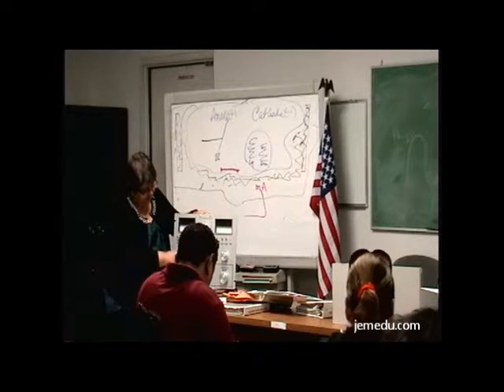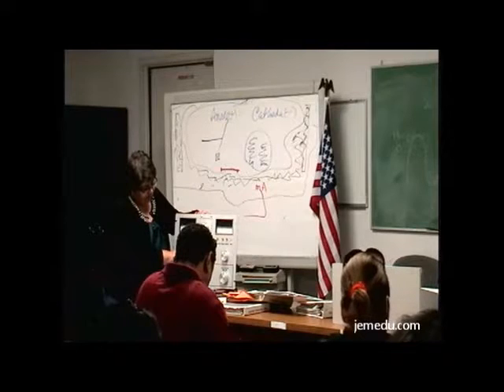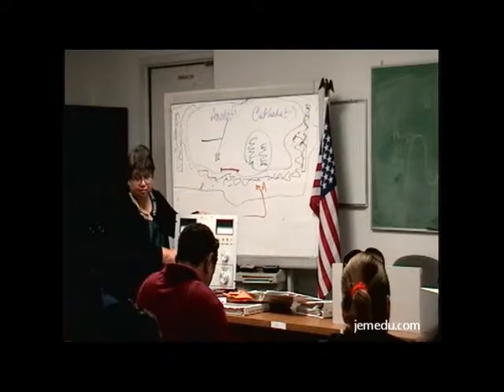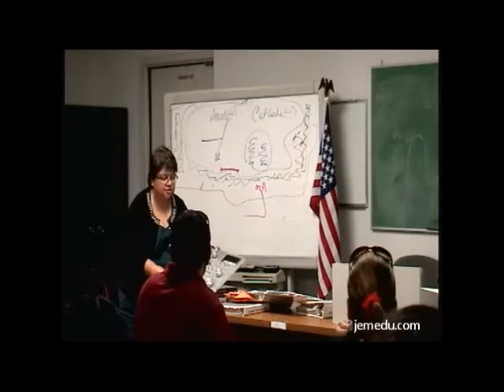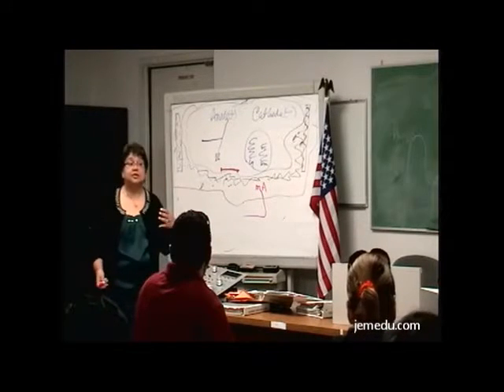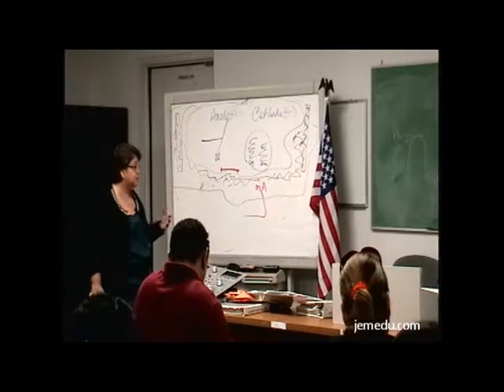This particular demonstrated console has 100 small, 150 small, 150 large, 200 large, 300 large. What I'm selecting here is the amount of milliamperage that I need, because milliamperage is inevitably going to give us our electrons.